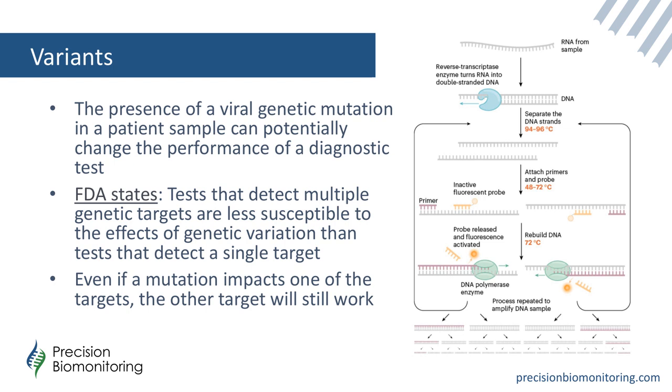So you might be getting much later Cq values or Ct values, or it means you're going to be getting negative test results when actually that target is there. It's just a mutated version of the target.